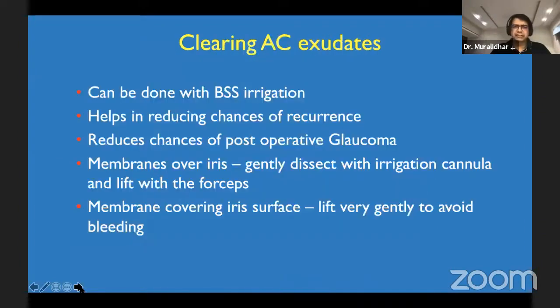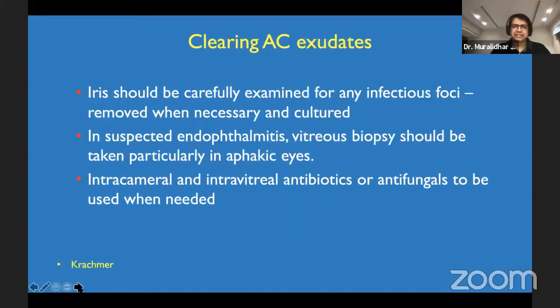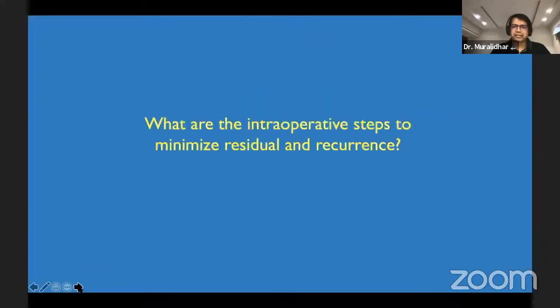although I don't prefer such an iridectomy. And as I said, one has to really inspect any iris lesions, lesions in the angles, lesions in the ledge that are generally overlooked. That's one of the important reasons for recurrence in the early post-operative period. Those foci should be eliminated.